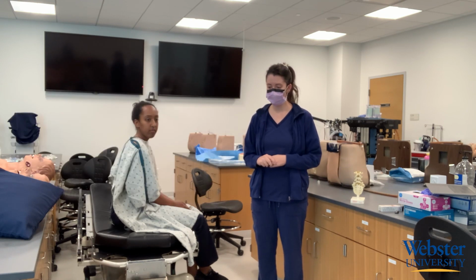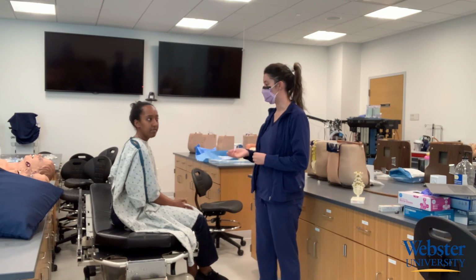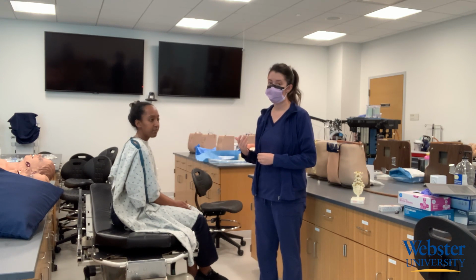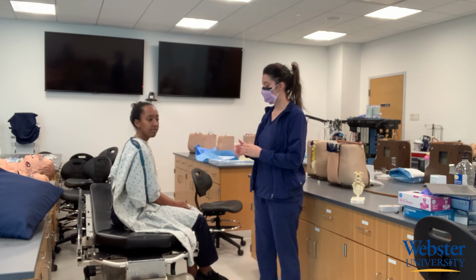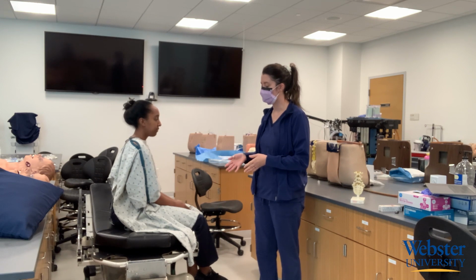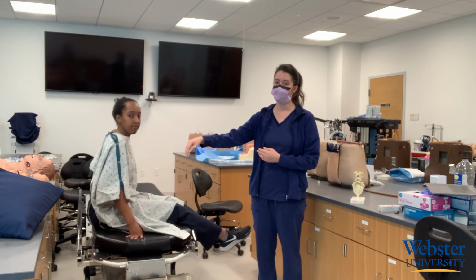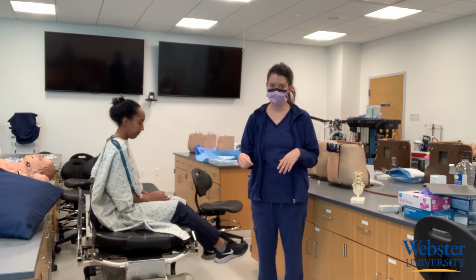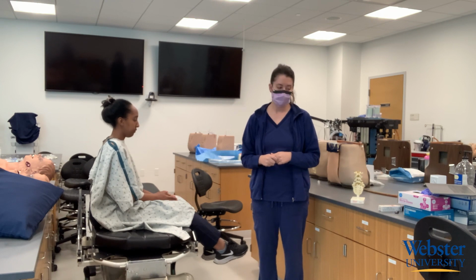The next step is to explain to the patient what the steps are and what is going to be required of them. When they are located where you'll be placing the epidural, have them move as far back as they can so when you're behind them, you don't have to lean over to reach their back. Positioning is also very important. You want them to stick their back out and hunch their shoulders over.